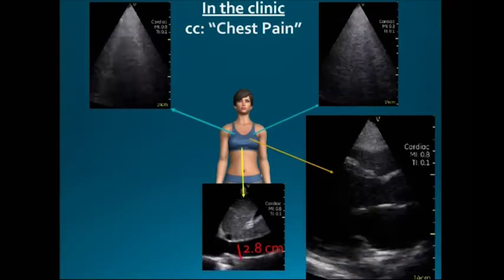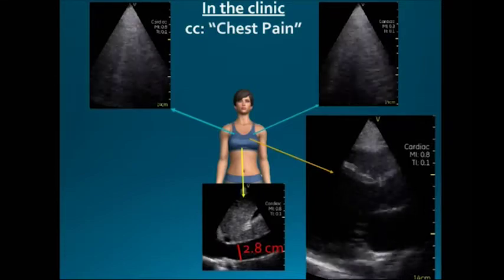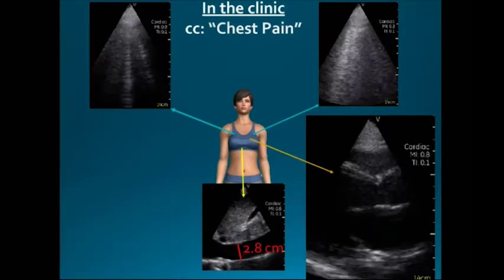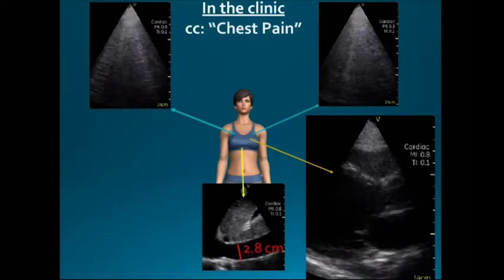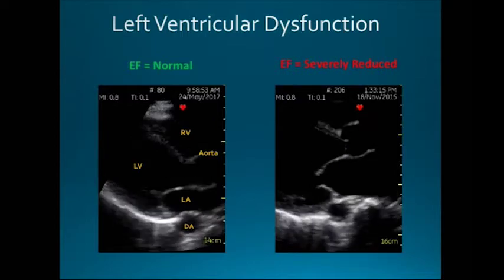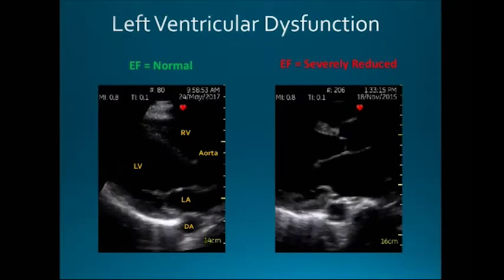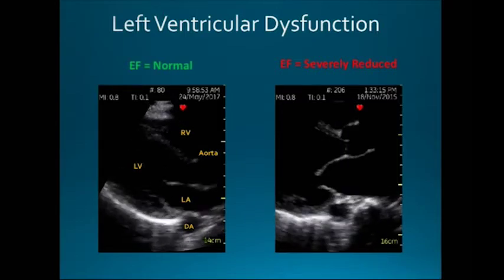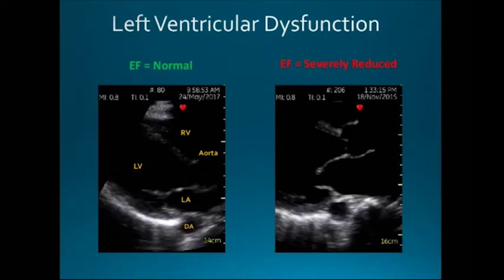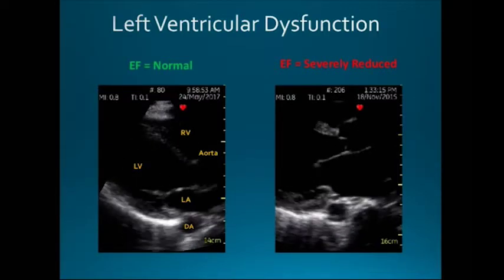And then also, with incorporating the lung and IVC findings, recognize that she's actually decompensated heart failure with reduced ejection fraction. And we did this in about 5 minutes. And so, how do you do this? Well, you hold the probe like this, and you're taking the heart here, and you're slicing the heart along its true long axis, which unfortunately is not straight up and down like this, and it's not side to side like this. You have to kind of come across it like this.